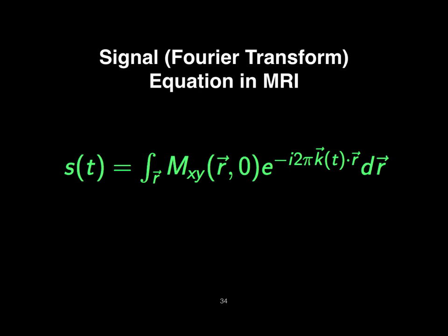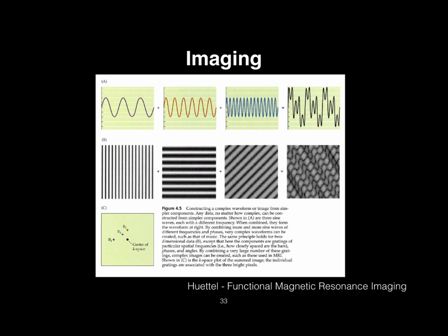Could you go back a slide? Can I ask a clarifying question? Absolutely. So in figure A, the three on the left are increasing in frequency, right? So the frequency is getting higher with the third one in A than it is in the top left, right? Yes. Okay, but how is that on Kx or Ky? Where is that frequency being encoded in k-space? Okay. So the question was, in this diagram, how do A and B correspond?